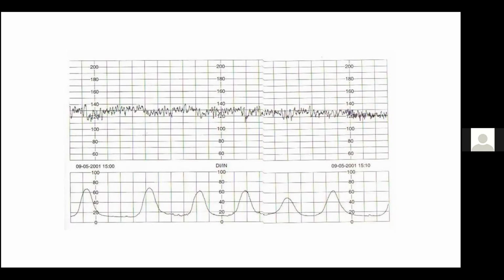What you can see on this trace is that when you're looking at contractions, you want to see the shape and you want a rest, because when there is a contraction, the baby is quite asphyxiated. So once the contraction ends, the baby needs about 2 minutes to rest before the next contraction starts. So all the time you want to see that shape: the contraction starts, there's a rest, the next contraction starts, there's a rest. And ideally the contractions should be less than 60 seconds in order for the baby to cope. Then the third thing we talked about just now was the variability.